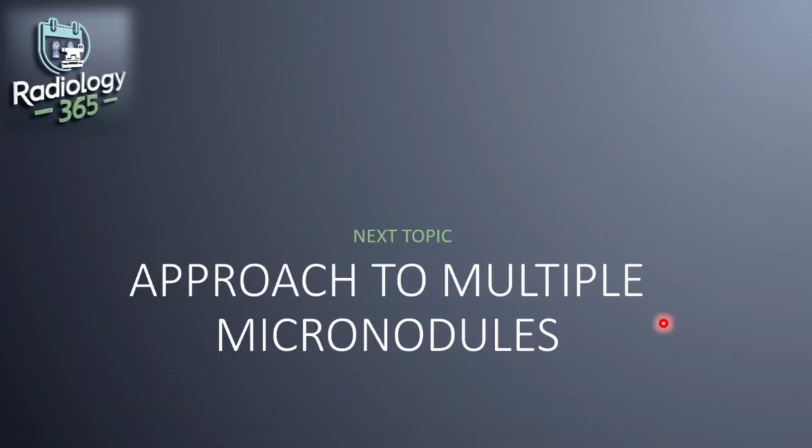The next thing we'll talk about is approach to multiple micro nodules.